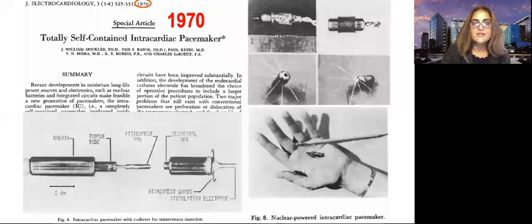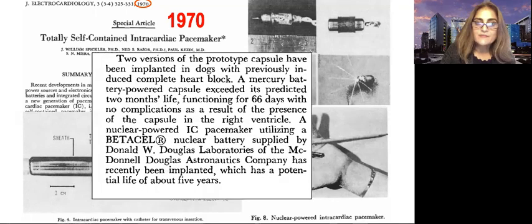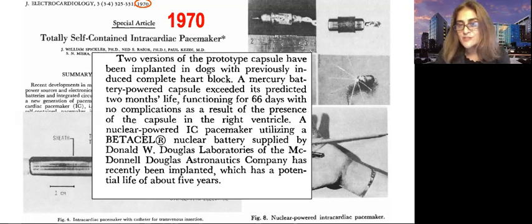Now, one might think that the leadless pacemaker is a 21st century invention. The concept of a leadless pacemaker was first conceived in 1970 with successful implantation in dogs. And as you can see here, the 1970 prototype of the leadless pacemaker is very, very similar to the Micra that we see today in the previous pictures that I just showed you. Now, the reason why this pacemaker was not successfully marketed in 1970 is because there was a lag in battery technology. And at that time, the only extended batteries were nuclear powered batteries. And therefore, the leadless pacemaker that was first invented in 1970 had to be shelved, and the technology resurfaced only in 2016.